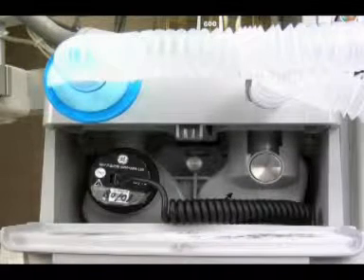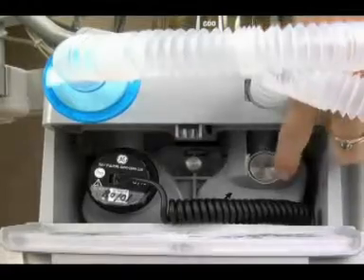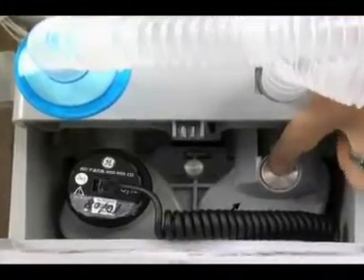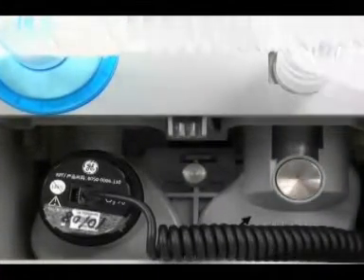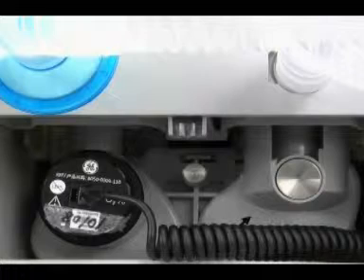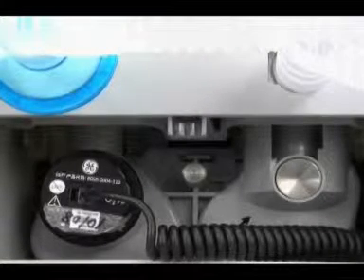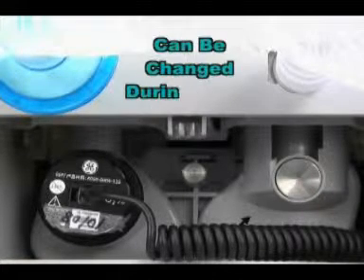To help reduce moisture in the breathing circuit module, a drain button is placed on the expiratory side. This button will permit moisture to go down into the absorber canisters and eventually into the drain dish. This button can be pushed during a case. The breathing circuit module can be changed during the case if necessary.